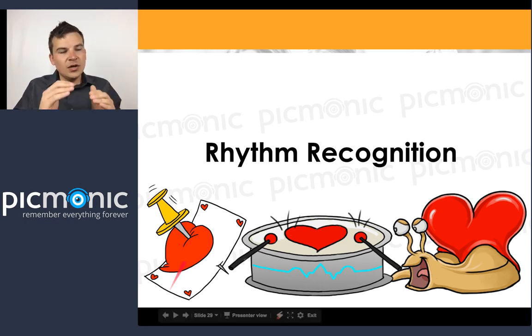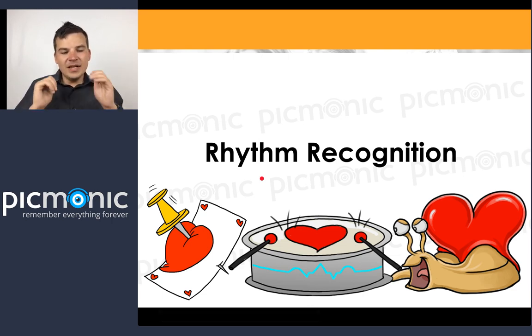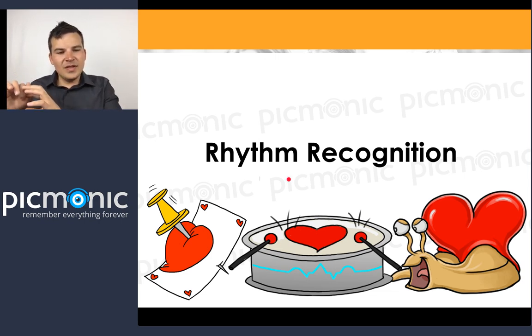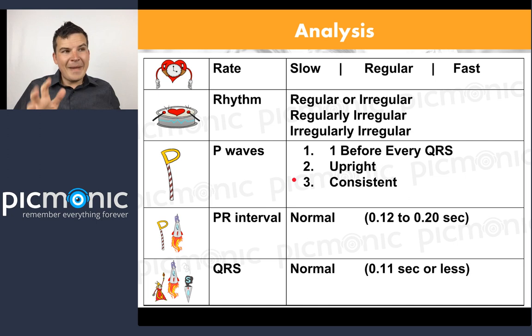If you've learned ECGs in a slightly different order, that's probably okay. You don't have to follow my order exactly, but it is a set order that equals success every single time. And then there's the weird stuff at the end, a few anomalies that you just have to know, and we'll talk about some of those as we go through. So this is everything we're going to run through today. If anything, we're going to make sure you're a master of the process, because that's what will help you understand what's going on and not make what I call basic mistakes, the things where you're like, oh my God, I can't believe I missed that. That's where so many people with ECGs miss the basic stuff.